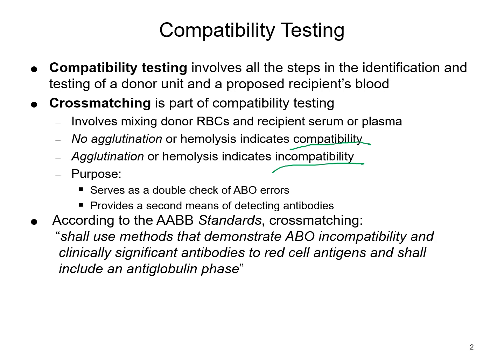So this is usually going to include that actual antibody screen that takes that recipient all the way through that antiglobulin phase, looking for any potential antibodies that are present. And that allows us to do that pre-screen to see if there's going to be anything that could potentially cause any problems.